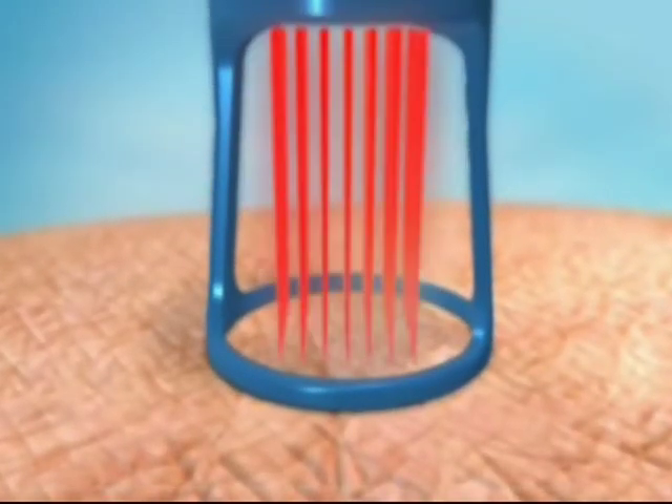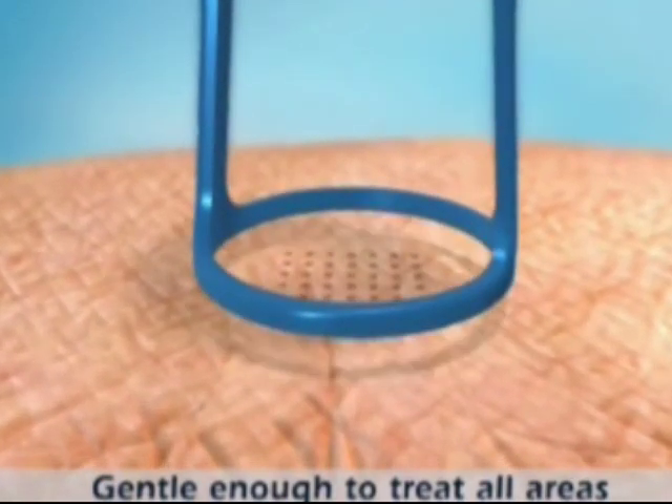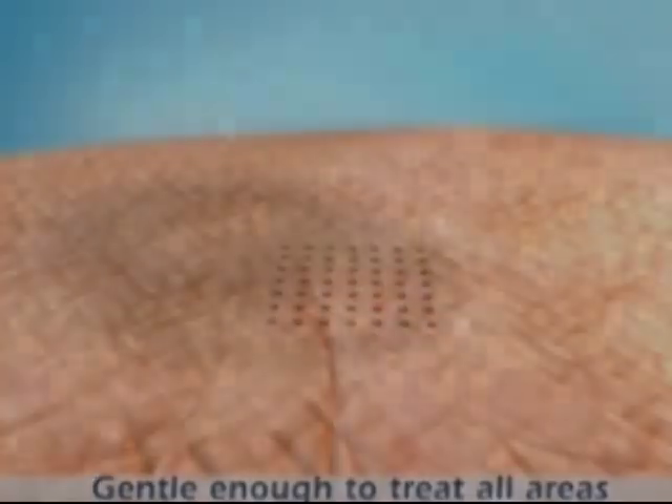Since only a fraction of the treatment area is affected, delicate skin areas such as the neck, chest, and hands can be easily treated.